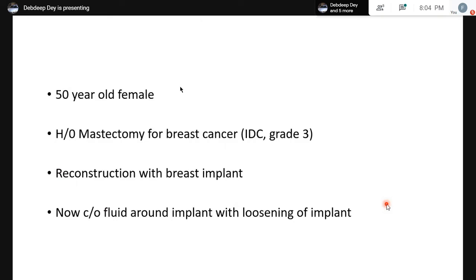So now we come to, we've done the high grade B, the low grade Bs that mostly happen in the MALT lymphomas. Now we come to the varied presentations of a T cell lymphoma.